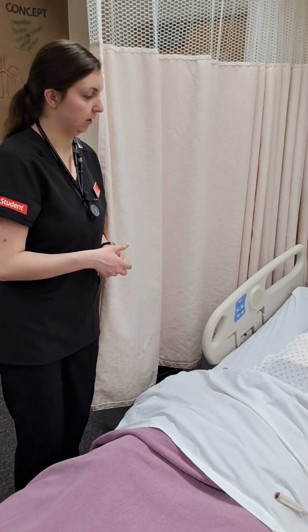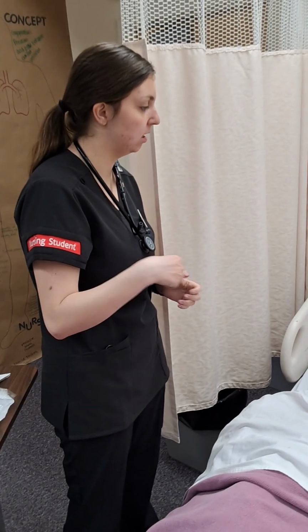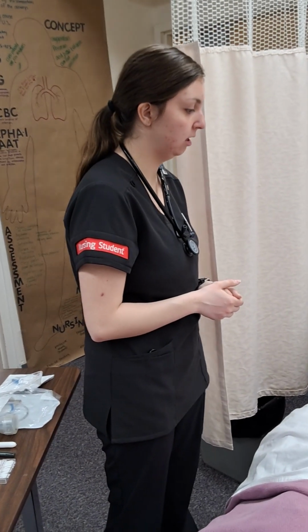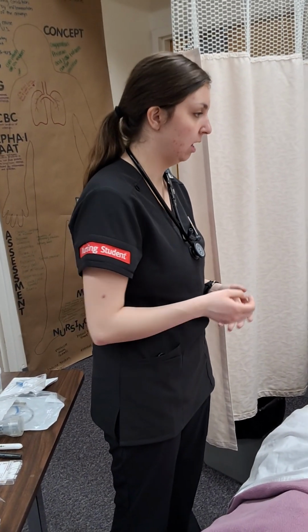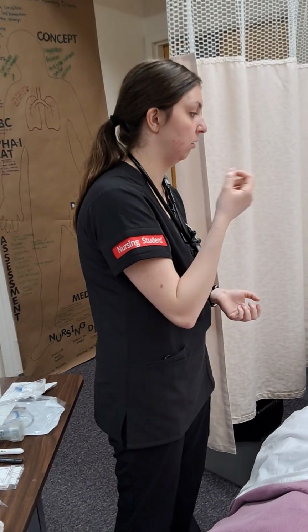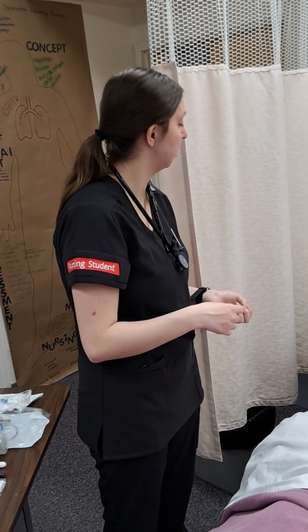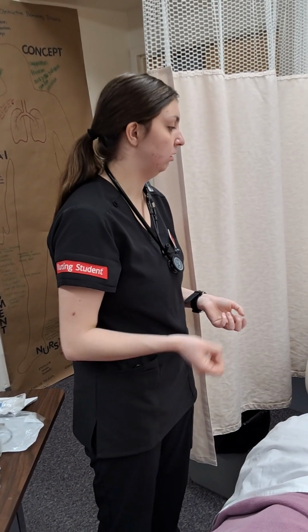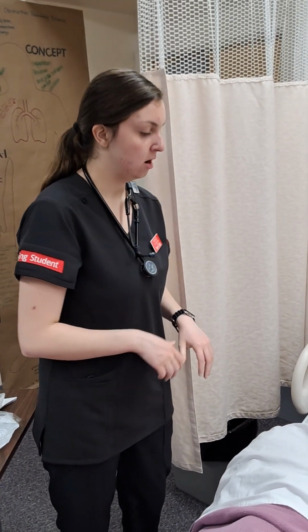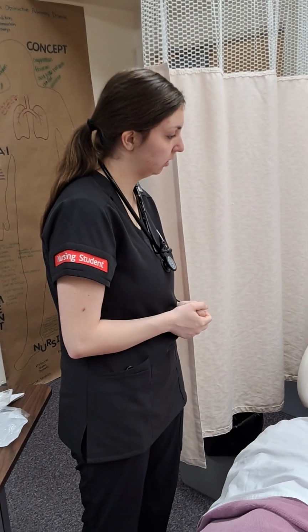Okay, Mr. Casey. So your doctor has ordered for an NG tube to be put in. It's for your gastric decompression because you have a bowel obstruction. An NG tube is a nasogastric tube. It's going to go in through your nose, down your throat, and into your stomach. And we're just going to hook it up to suction, and we'll decompress your stomach. This procedure is not supposed to hurt, but if it does, raise your left hand and I will stop. Do you have any questions?